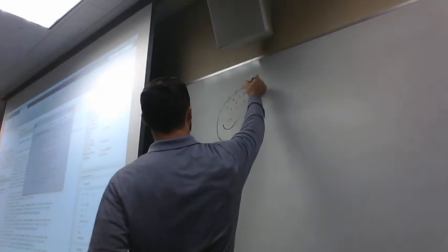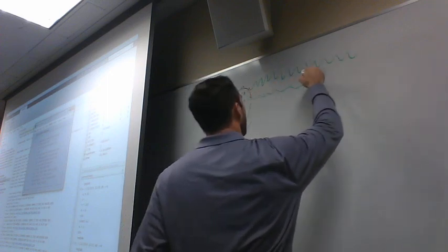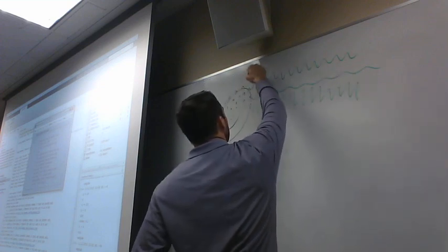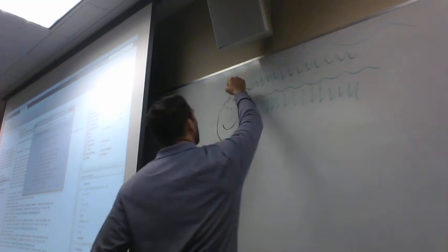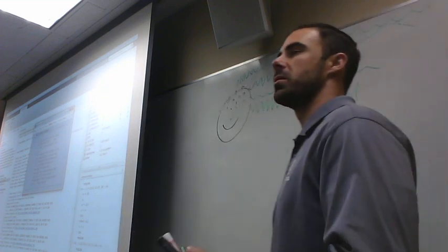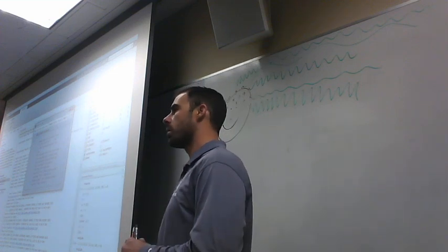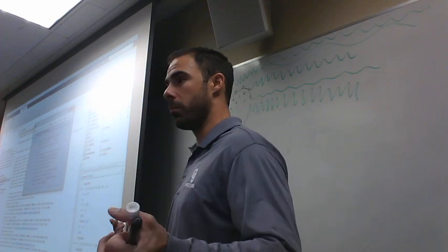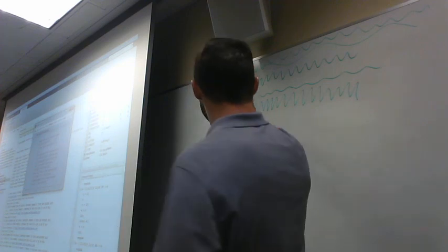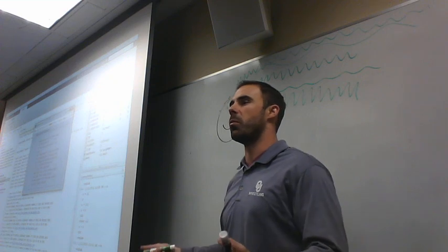Now, when this is happening, each one of these electrodes is recording a pattern of activity, and that activity oscillates. It goes up, it goes down, does all sorts of wacky stuff, because the person is alive, we hope. Flat lines are bad. So every single one of these is going to have a different trace. And because we have 32 electrodes, we can number them 1 to 32.